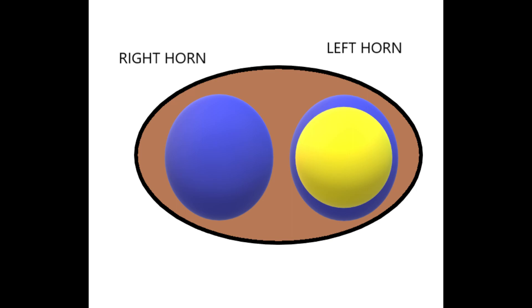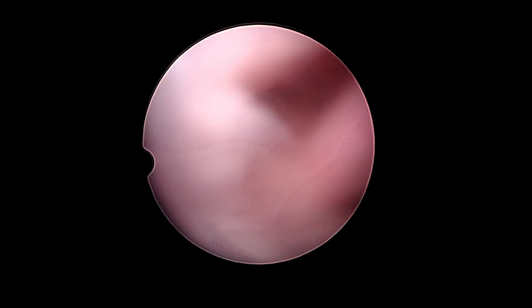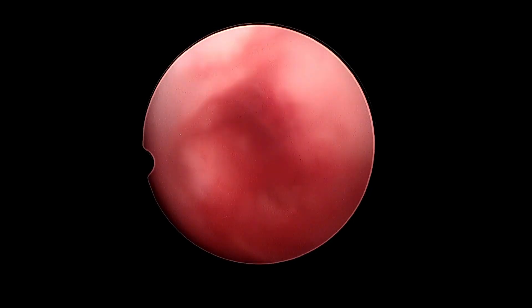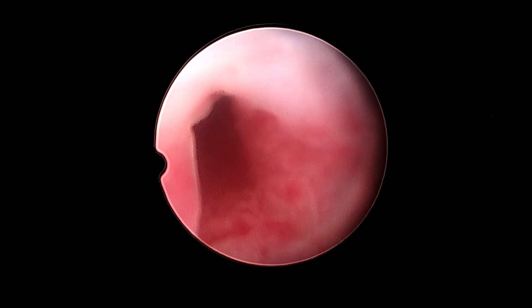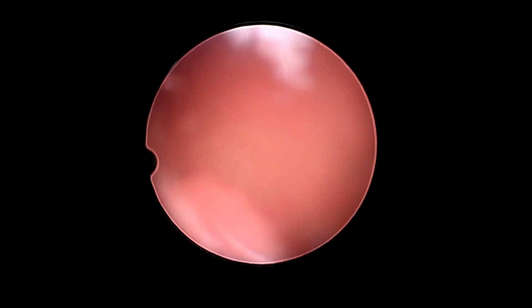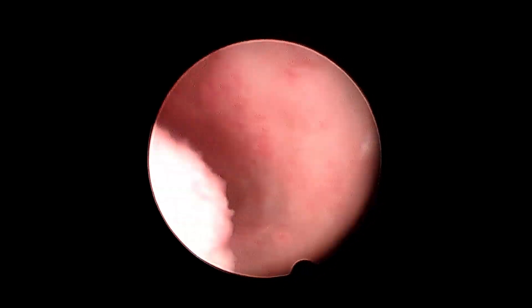So hence we put a Foley's balloon in one horn and do the hysteroscopic resection of the septum above the internal os. Now we are doing hysteroscopy before any surgical correction, and as you can see we are entering by vaginoscopic approach into the right side of the cervix. Once you negotiate the internal os, you realize that you have entered into the cavity of the uterus.